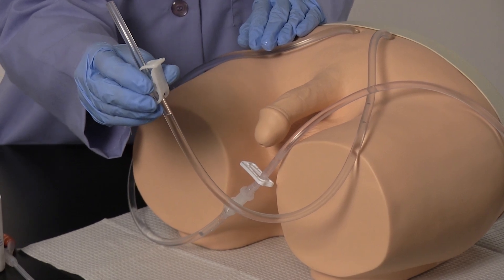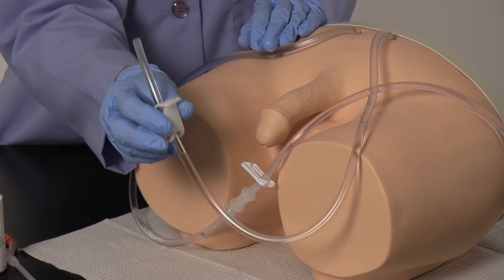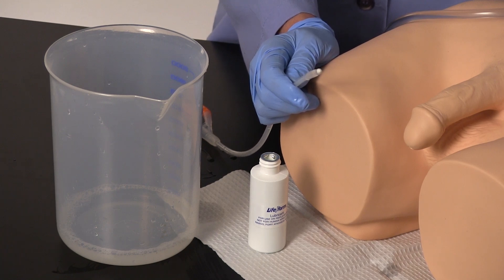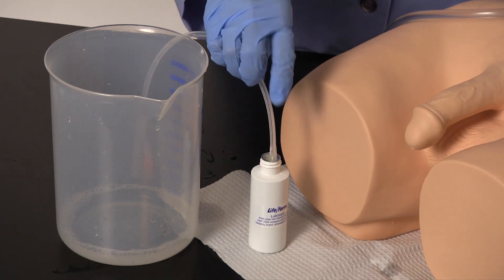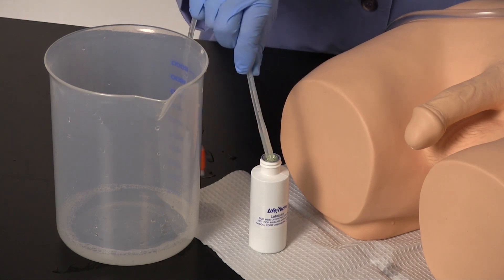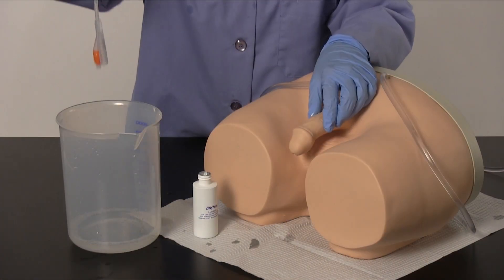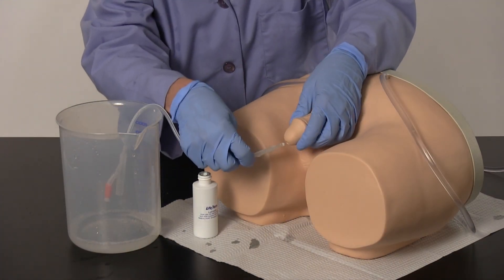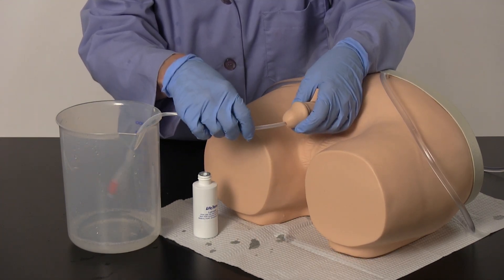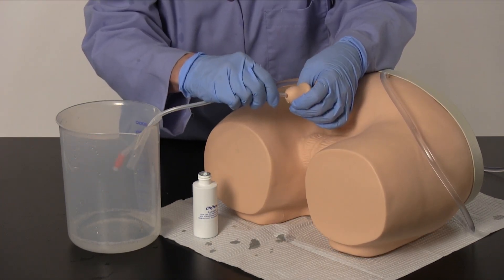Your simulator is now ready to perform catheterization procedures. Retain a water-safe basin or catheter bag to catch the water upon successful catheterization. Start by generously lubricating a 16 French silicone Foley catheter using the supplied Lifeform lubricant. In the normal hanging position, gently insert the lubricated catheter.